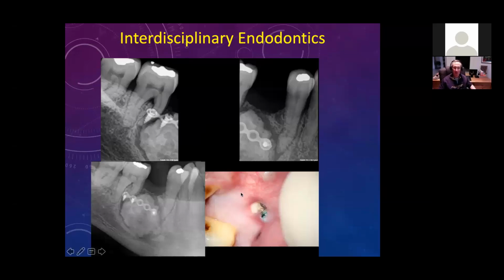So that's what we did. In case you're wondering what this picture is, this is the graft material, and a little bit of one of the screws is eroded through the soft tissue. So then we scan this patient, as we do with most of our patients. And again, I'll ask the audience, what sort of information are we trying to gain from this scan? Well, we're interested in what kind of graft site this is, how much vertical and horizontal bone there is.